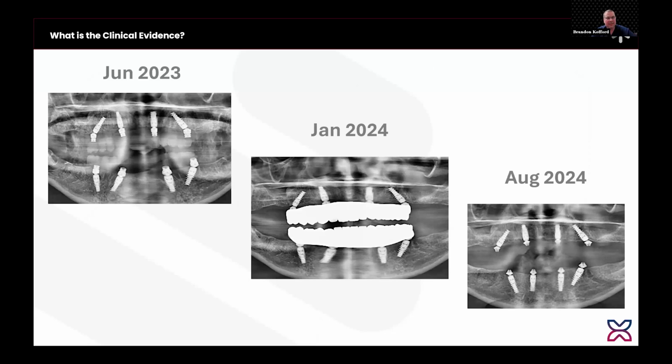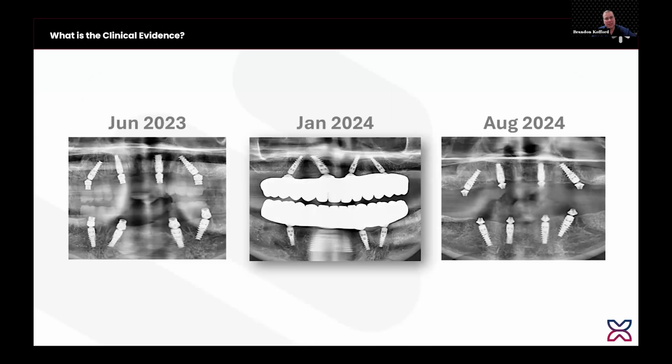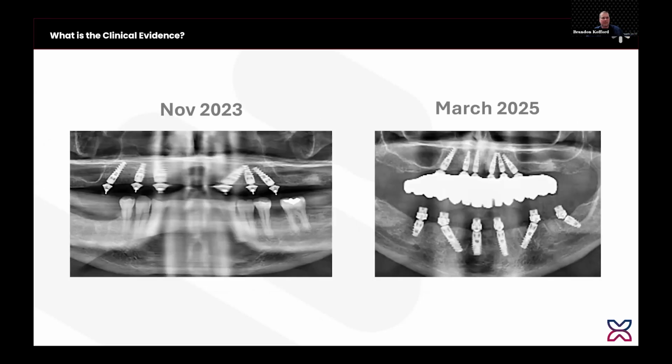This is an all-on-4 case, right? So 4 is the minimum number, but you can go up to 7, 8, 9. I don't care. Again, all-on-4 case. And we just see the bony and soft tissue contours just seem to really like these contours of the abutment. Again, speaking to the cleansability of the abutment. If the prosthesis is cleansable, the abutment is cleansable.